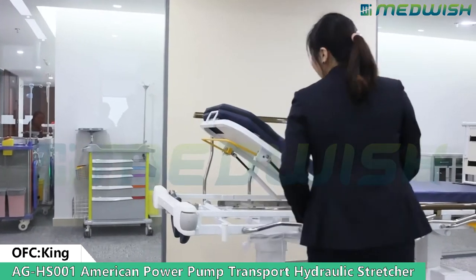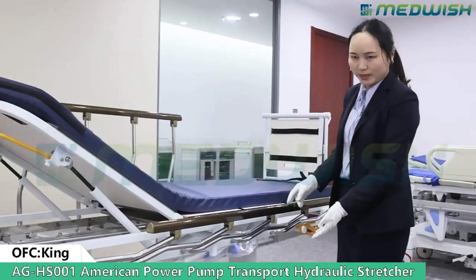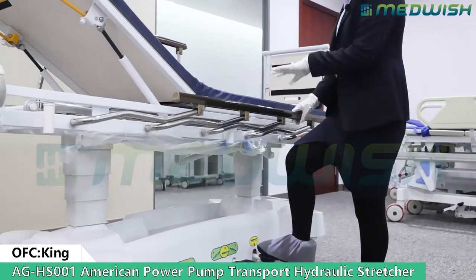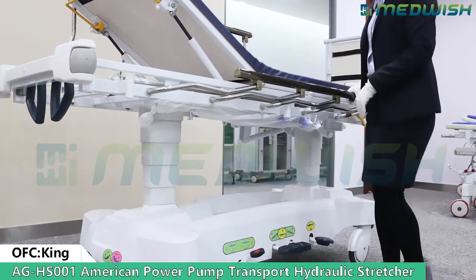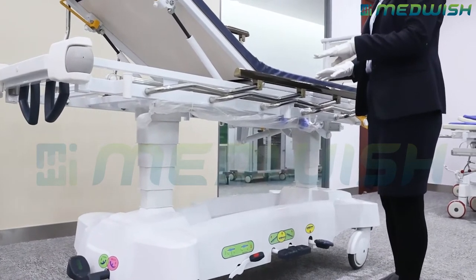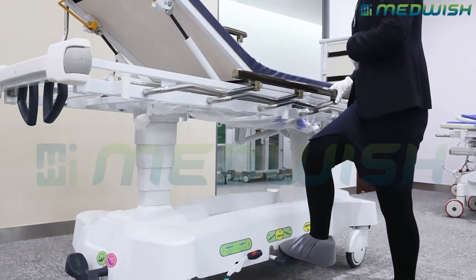For this stretcher, all the functions are controlled by the hydraulic pump and by these two pedals. The first one controls the height — to lift it up. The second one can control the height of the stretcher and also the Trendelenburg and anti-Trendelenburg positions — to lower down.